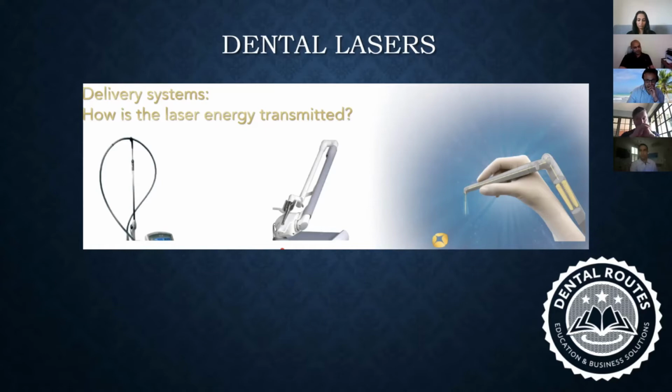Okay. And the second part I wasn't very convinced about is the ease at which you can maintain it in a day-to-day practice setting. All it takes is one wrong move and you break the cable. And do you have good amount of support and do you have good amount of facility within the supplier group to make sure that can be replaced easily? It doesn't lead to discontinuity in your care. And that is where I started to have questions. And then I started to investigate more about other appliances in the market.